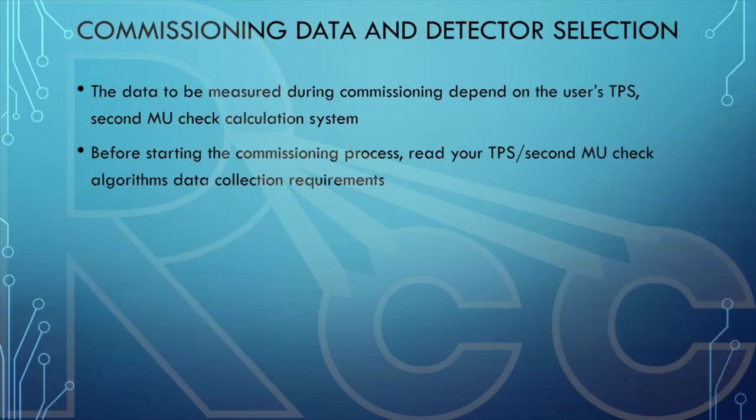So when you are commissioning, it's very important that you know what type of measurement you need to acquire. It's very, very important that you are familiar with your treatment planning system by reading your algorithm data collection requirements.